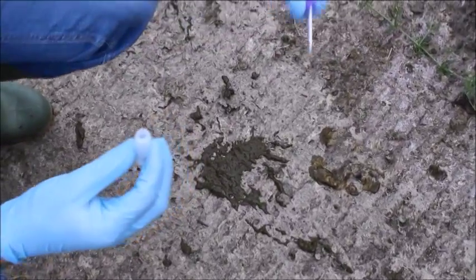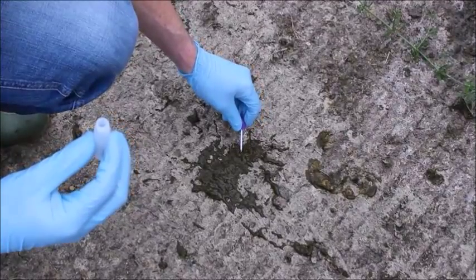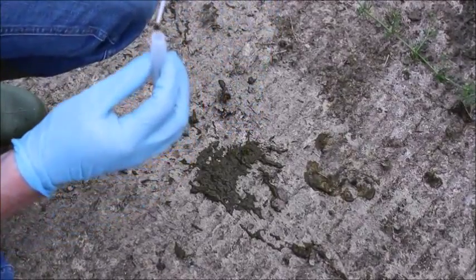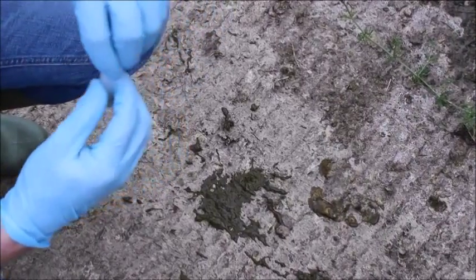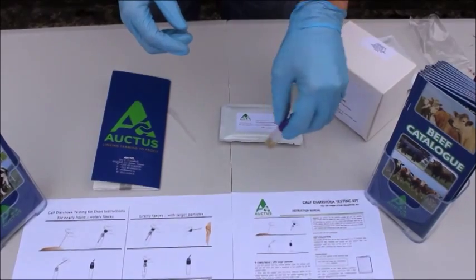We can then take the faecal sample with the probe by basically sticking it into the faeces and then putting it back into the bottle. Once the faecal sample is taken, it can be mixed up with the reagent.